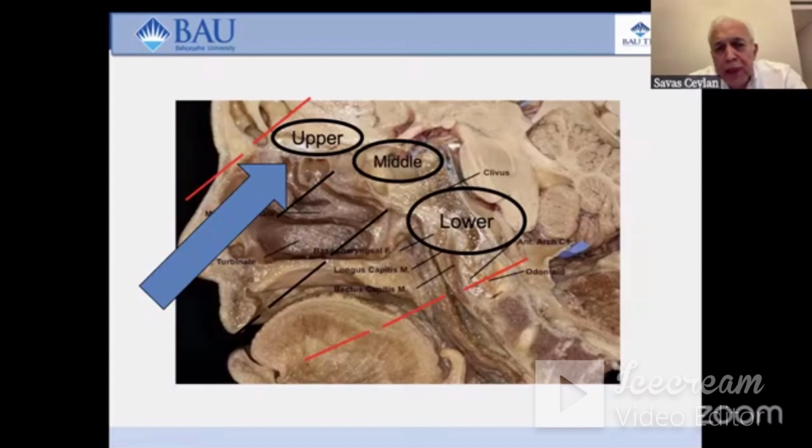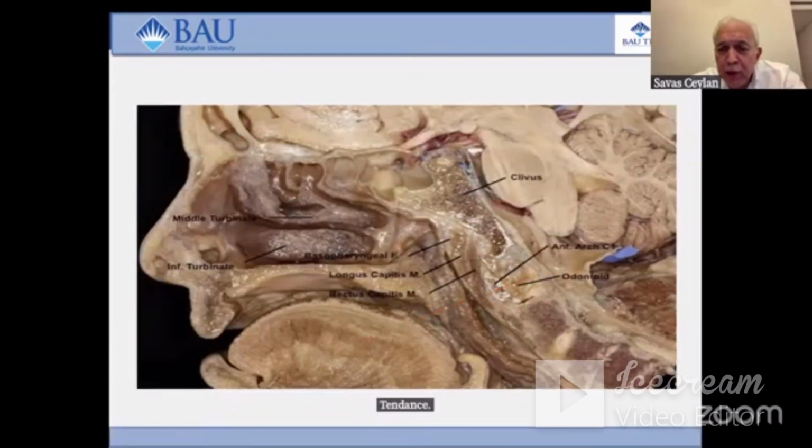All midline skull base lesions can be approached with the extended endoscopic approach, and the lower clivus includes the craniocervical junction. These are the anatomical landmarks: the lower clivus, the odontoid tip, the anterior arch of C1, craniocervical muscles, and the buccopharyngeal fascia.